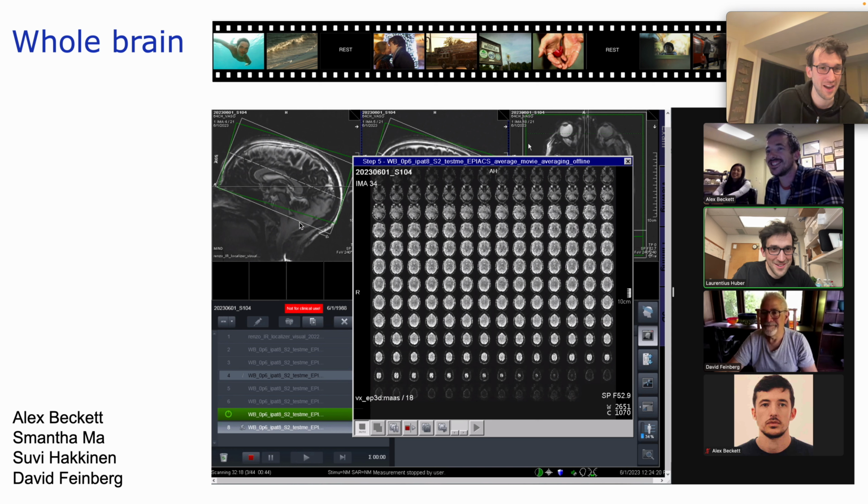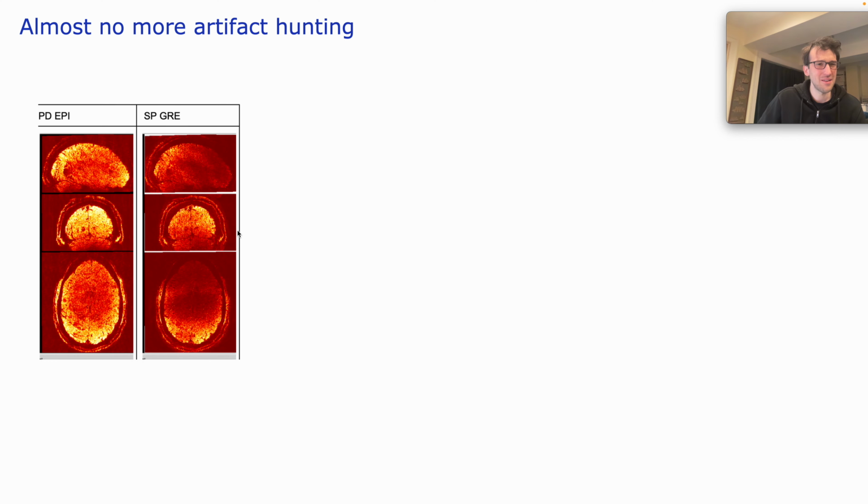And you can see the kind of coverage that we were aiming for. The residual artifacts that we were trying to solve were referring to kind of segmentation noise and eddy currents that we could mitigate with a dual polarity readout averaging approach to help our TSNR.